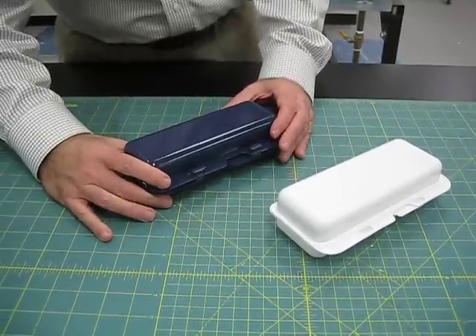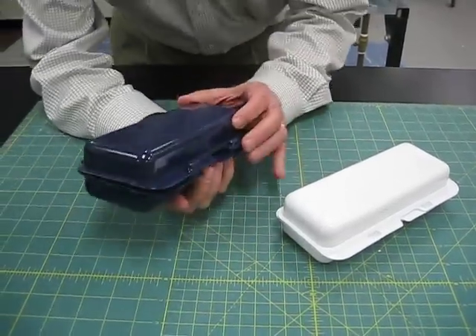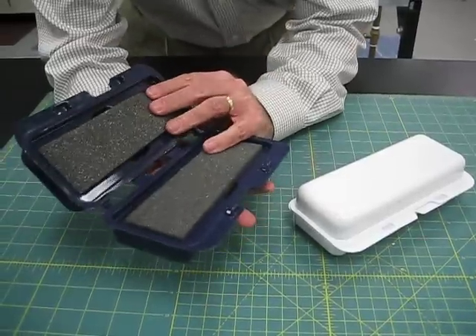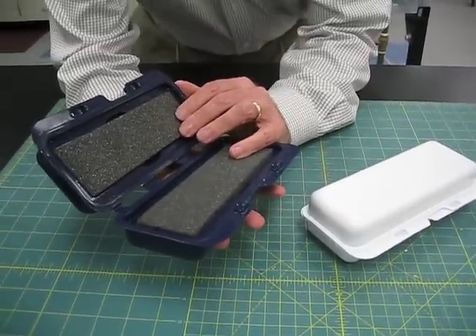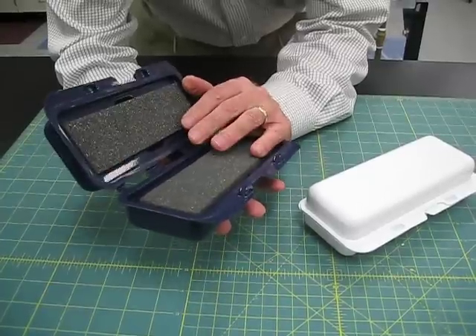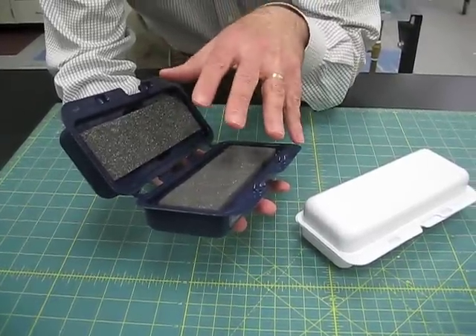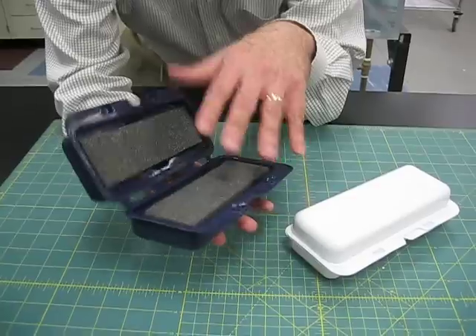This is the PenPak Personal Carrier for temperature-controlled products. It's designed so that one person can take their temperature-controlled items, such as an injectable pen that's refrigerated, and carry it for short distances while maintaining its refrigerated state.